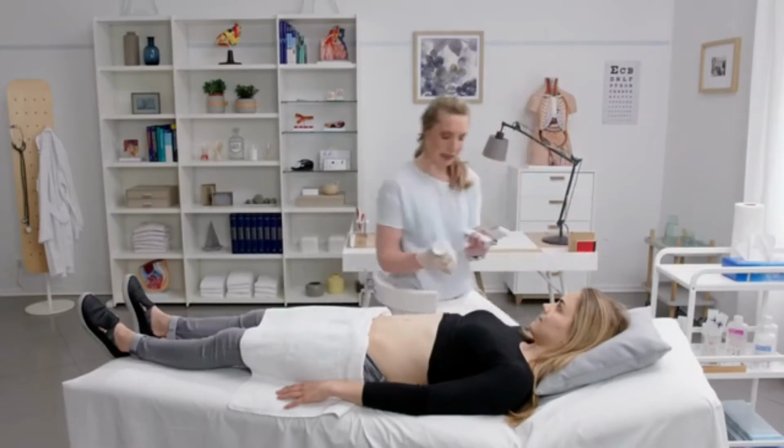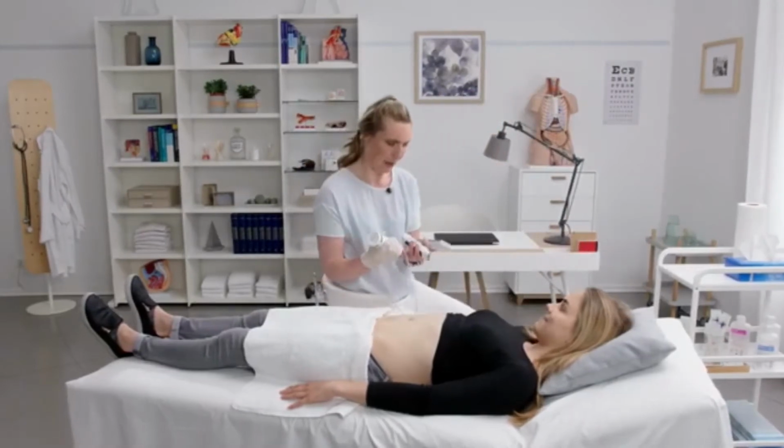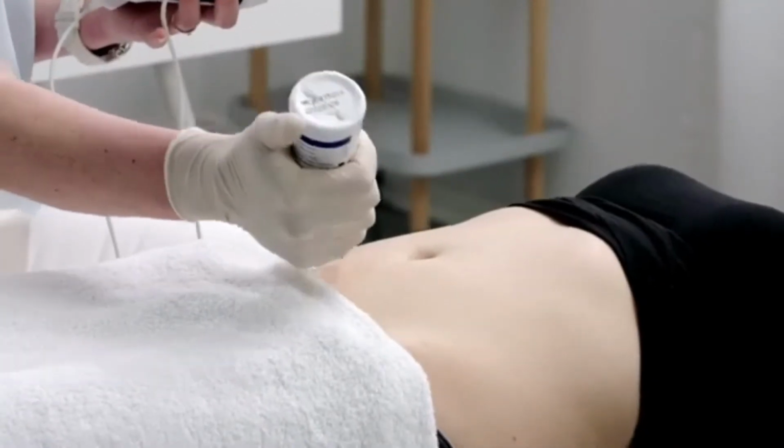I'm going to put a little bit of gel on your belly. It's going to be a little bit cold. Sorry for that.